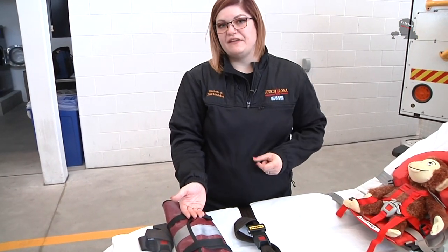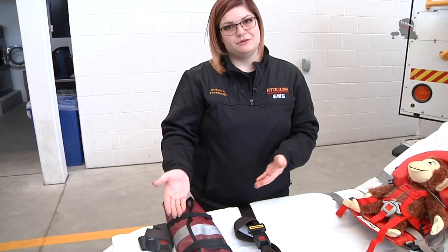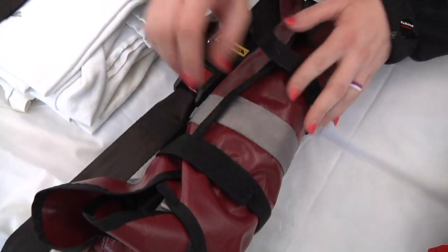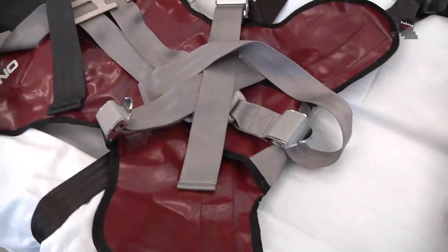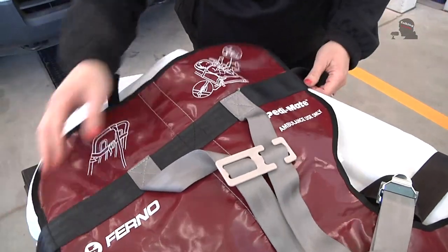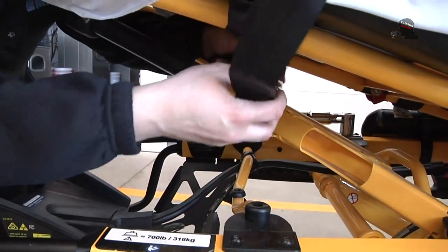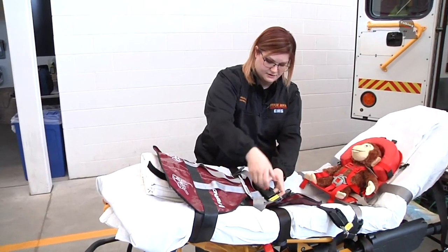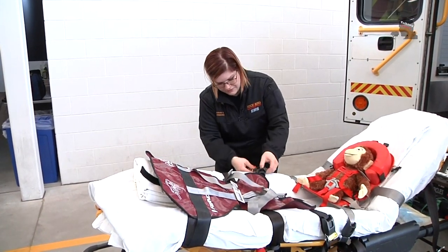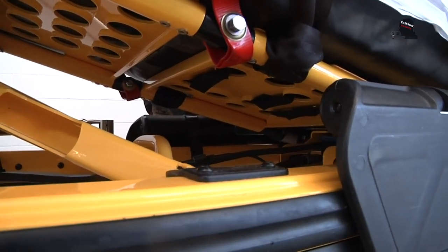And this isn't new to the service. We've had this for quite some time. It's just another device, a portable car seat, to do what this does with bigger children. So, deploys the same way, it unrolls. This takes children and infants from sized 15 pounds up to 40 pounds. So it deploys the same way, to the head of the cot, secure like that, with these buckles securing to where the mattress would go on the side of the cot.